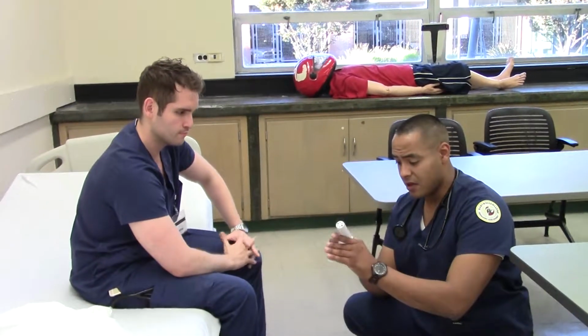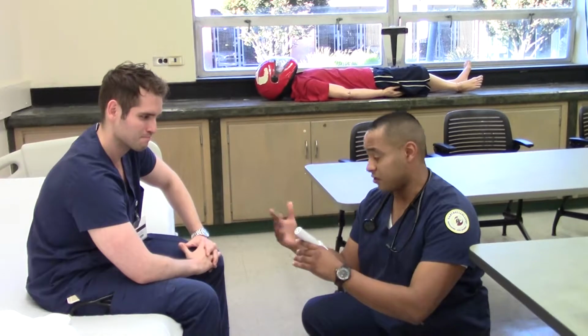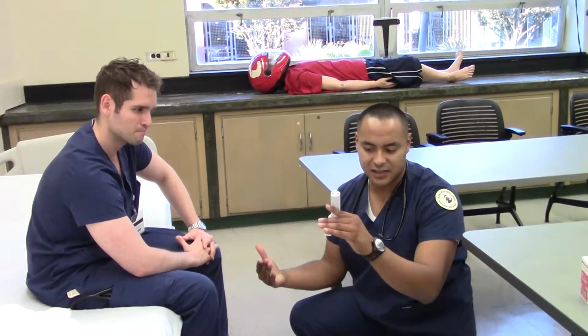Try to go fast here. Let's go home. Anyways, patient. Third time, great. You know, let's say it's 350. He's below his value. Okay, so you write this down, 350.